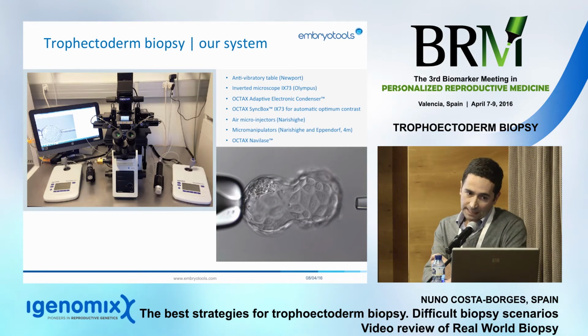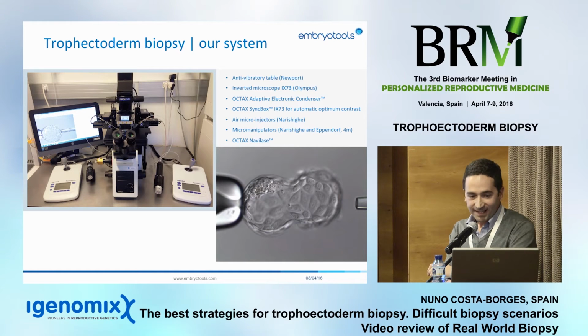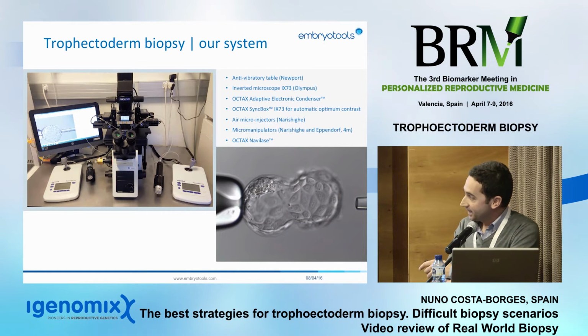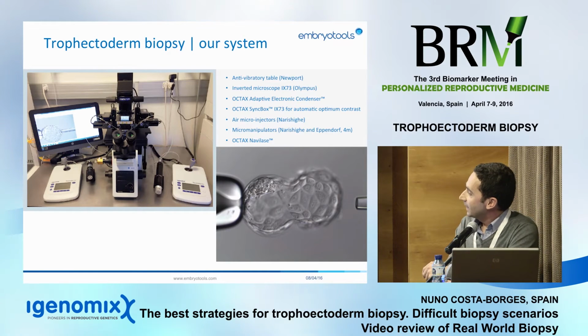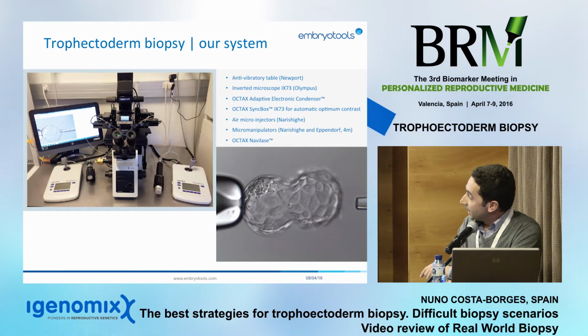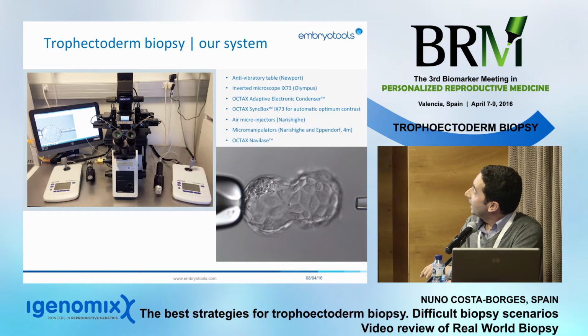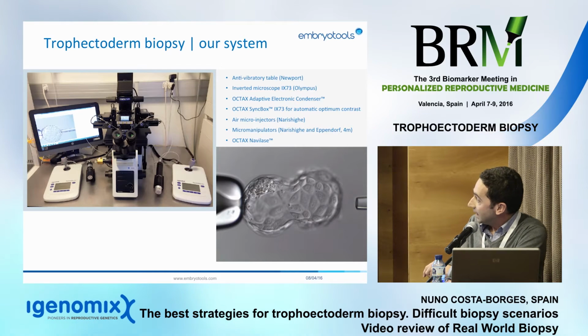In our lab we're very lucky because we have the most modern technology available in the market, and this includes an anti-vibratory table where the whole surface is anti-vibratory, so we can jump next to the microscope and we don't feel any vibration in the pipettes. We also have an Olympus microscope equipped with very good optics and lens.